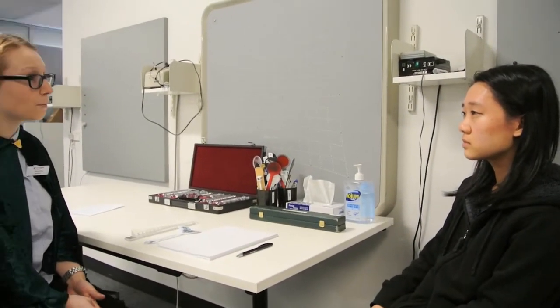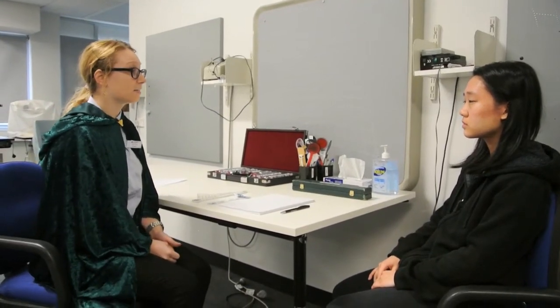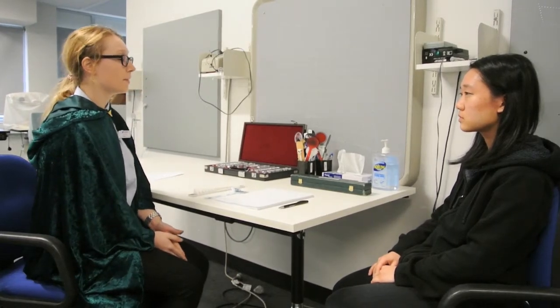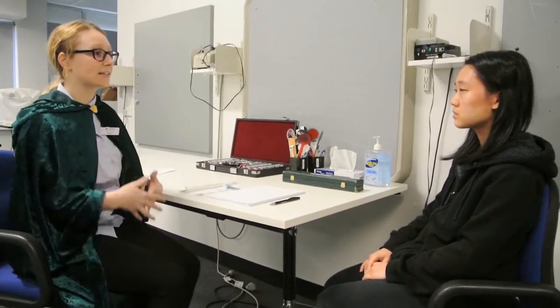Today I'm going to try and figure out why you're experiencing these symptoms. I'd like to do some tests on your eyes, if that's okay? The first test is going to involve measuring how much your eyes can converge and diverge while maintaining single vision.